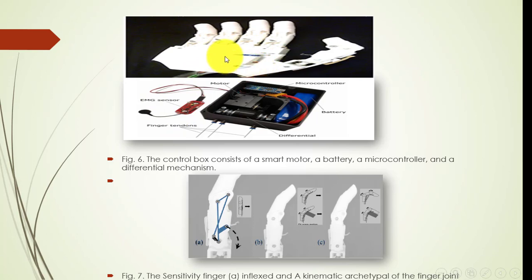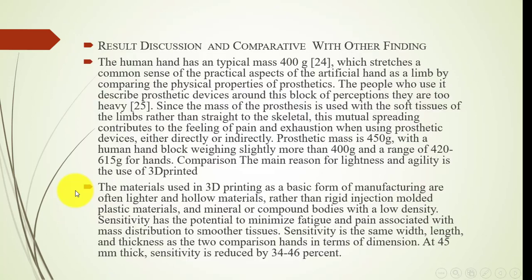This is the hand design, and this system can work with different movements and catch different objects like glasses, cups, and anything like this. For the result and discussion, our design is compared with the findings of other researchers.